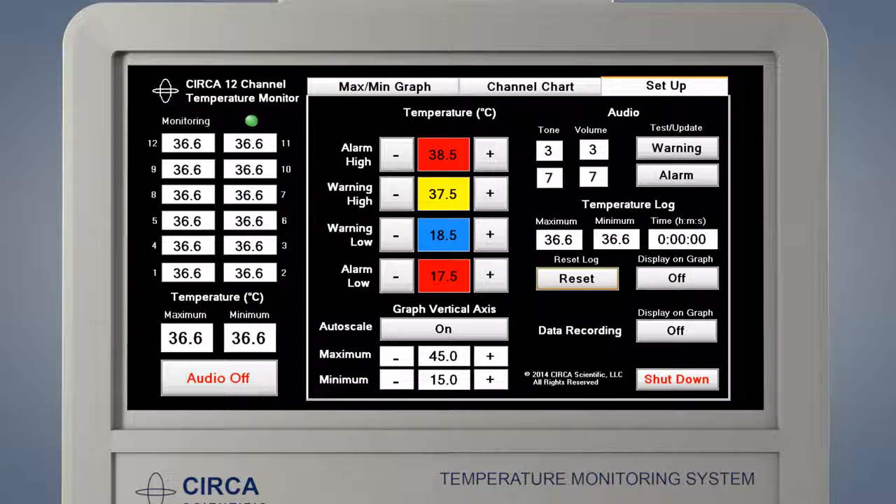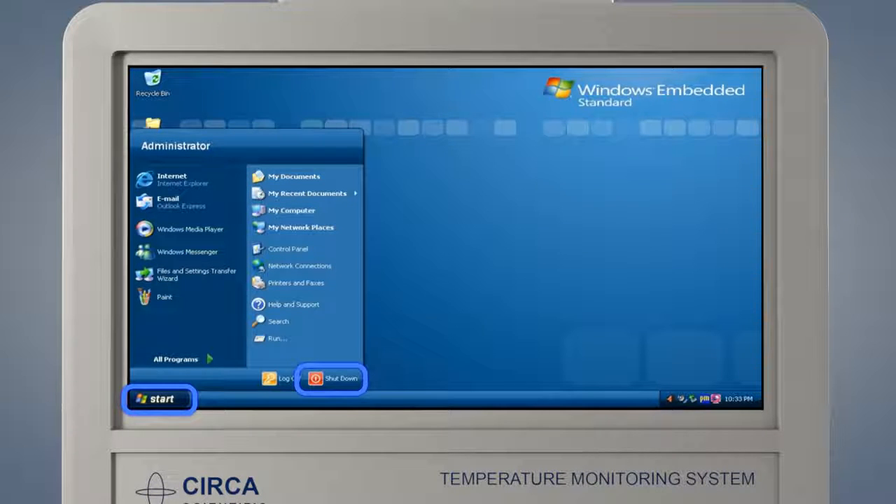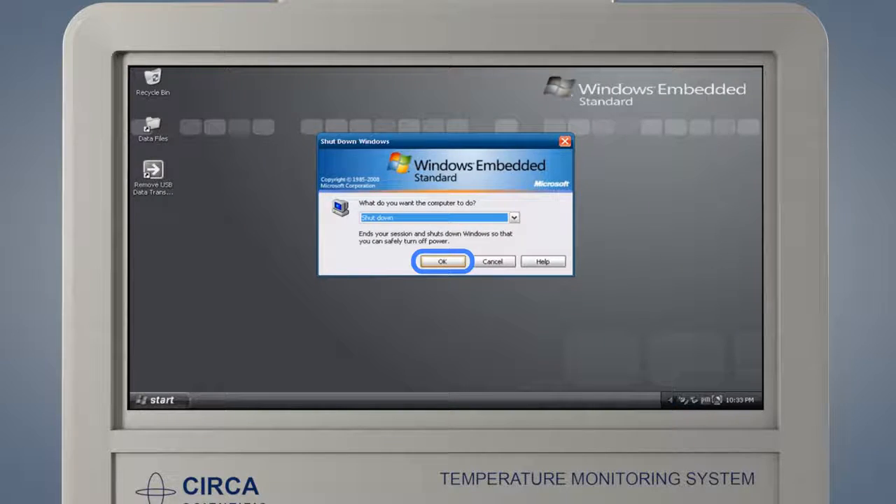At the end of the procedure, disconnect the interconnect cable from the probe and slowly remove the probe. The CERCA monitor is now ready to be shut down. The power button on the back of the monitor should never be used to shut down the monitor. To properly shut down the CERCA monitor, go to the Setup screen and press Shutdown. This will close the CERCA software and return the user to the monitor home screen. Touch the Start button and then press Shutdown. Touch OK to complete the shutdown process.